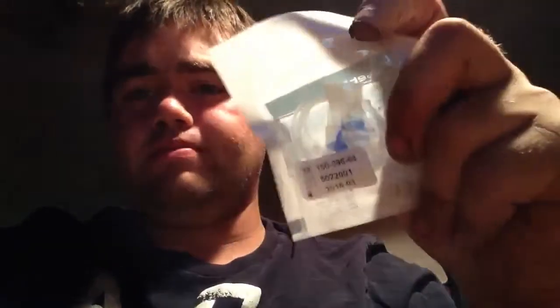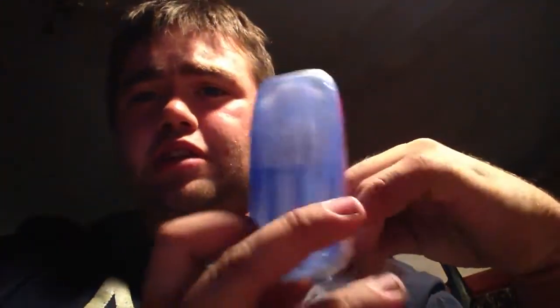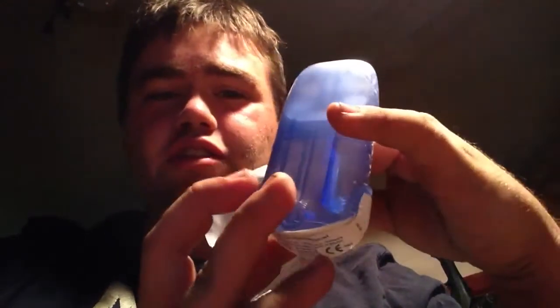These come in a box of 10 with the tubing, which I'm going to change today too. The tubing only lasts for about 6 days, but they come in the box with these. The life of these is about 3 or 4 days. Sometimes you can bring it up to 6 if you're lucky, but I try not to do that.